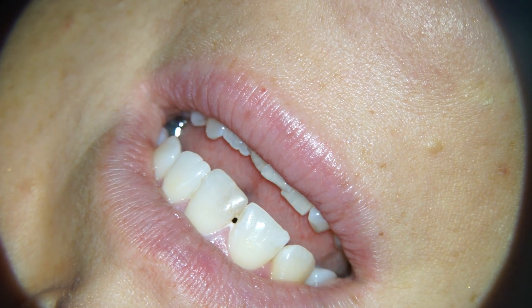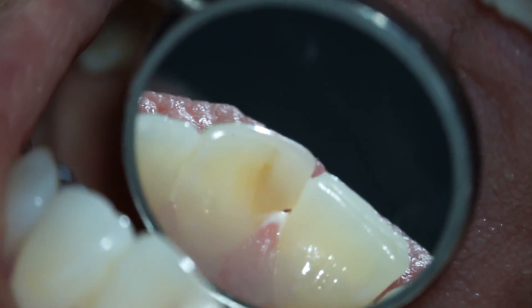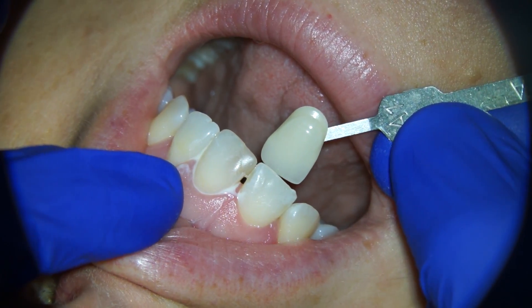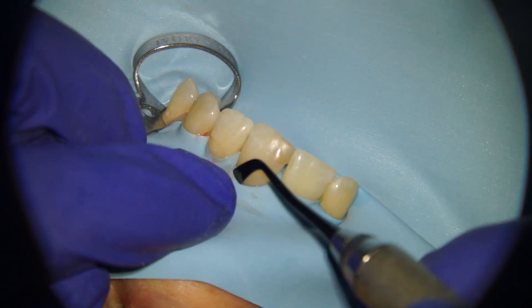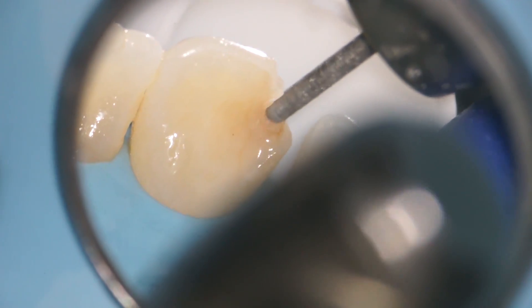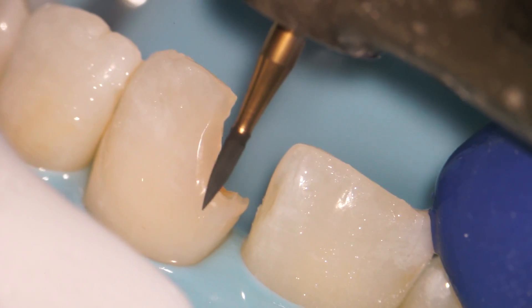This patient came into my practice wanting to get this filling repaired. She had an old white filling that was starting to separate in the back. She was not concerned about the little black triangle that you see between the two front teeth, nor was she too concerned about matching the color perfectly, so we opted to do just a replacement to this filling instead of trying to do something much more invasive. Here we're removing the filling and getting all the old material out to expose any decay underneath. In her case there was just a mild amount of decay that we removed.